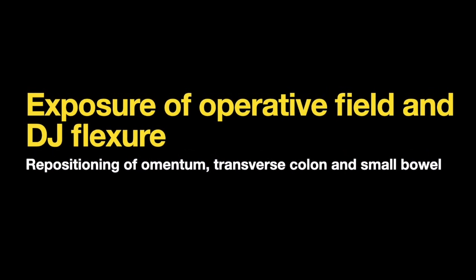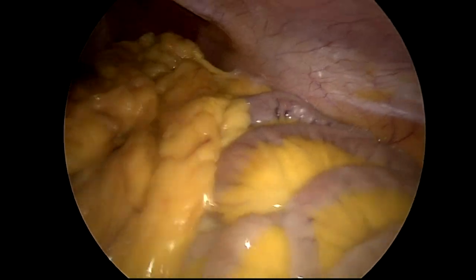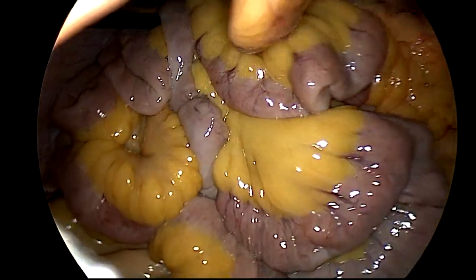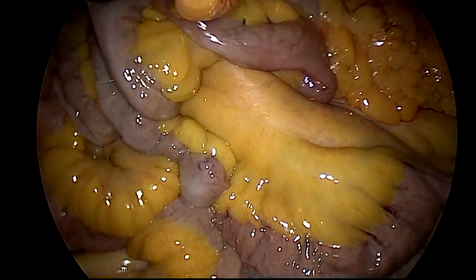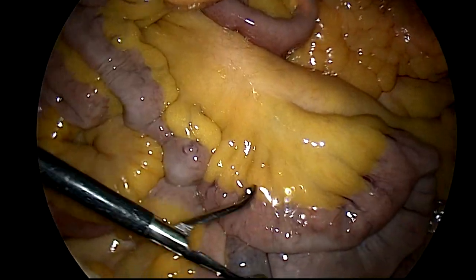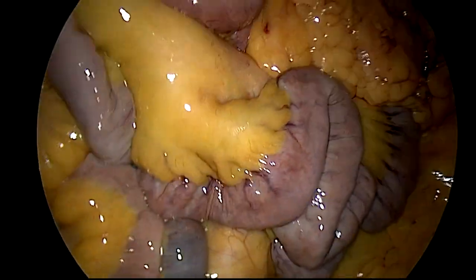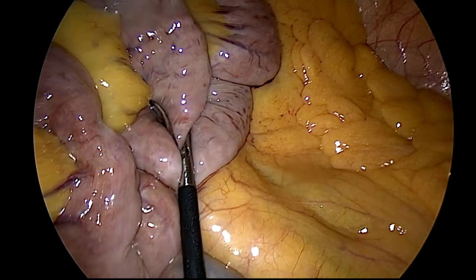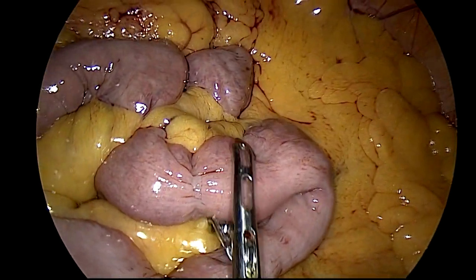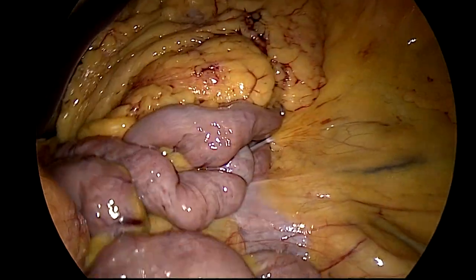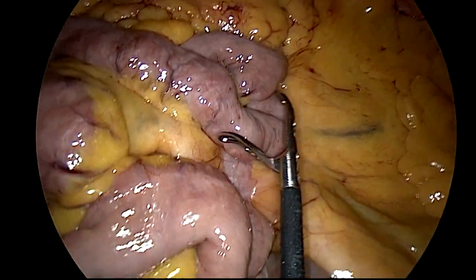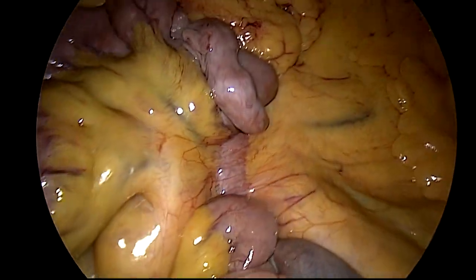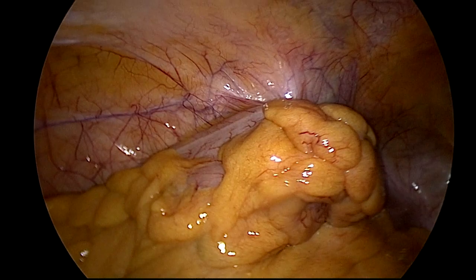It is crucial to expose the operative field, which includes exposure of the root of the mesentery, DJ flexure and the inferior mesenteric vein. It is worthwhile spending a few moments here before rushing to the actual dissection. The omentum and transverse colon is rolled up and positioned beneath the liver as shown. The small bowel is arranged loop by loop in the right upper quadrant, making sure to position them in a proximal to distal manner. The lesion is seen over there.